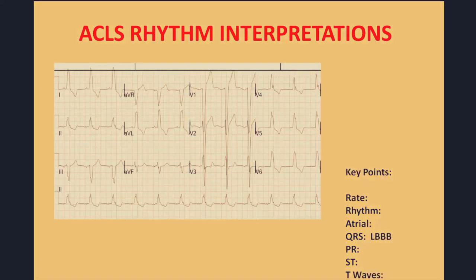During the early course of this presentation, we saw cases of right bundle branch block, and even two slides before we saw a case of a right bundle branch block in the presence of an anterior myocardial infarction. This is an example of a left bundle branch block, and here we have a wide QRS complex in AVL and in the lateral chest leads associated with deep wide S waves in the anterior leads. So this is an example of a left bundle branch block.